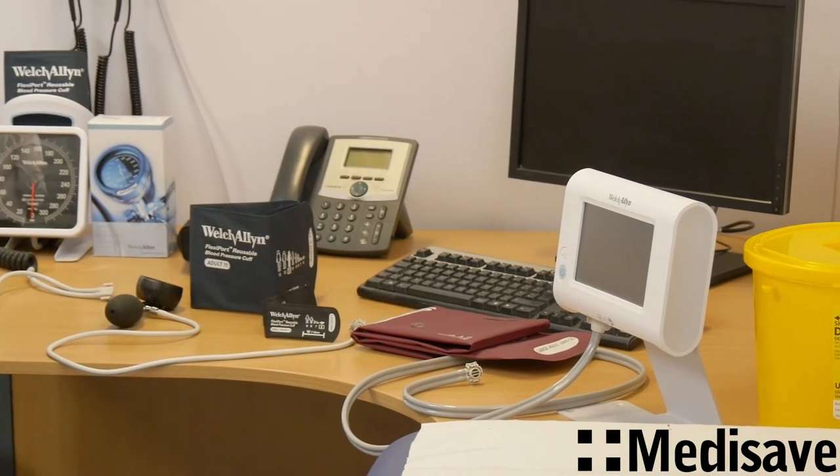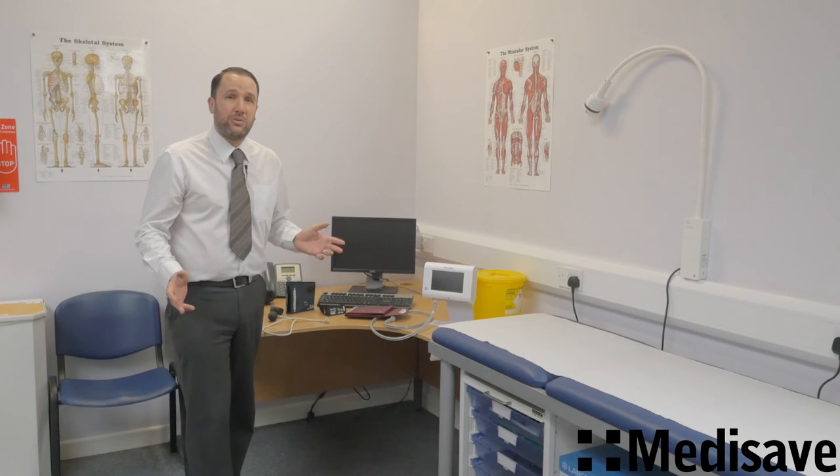This is standard across the entire range of Welch Allyn Sphigs, and it really is a very neat item. If you want any advice, give us a call — Medisave, 01305 784447. Many thanks.